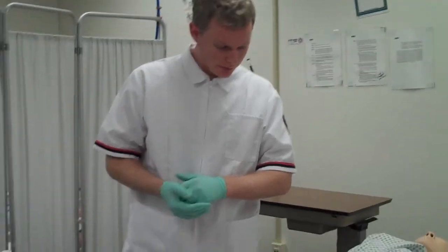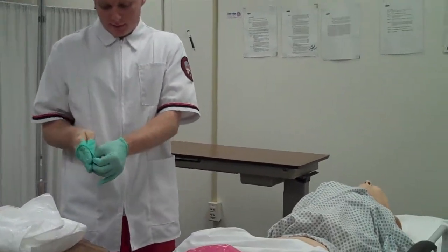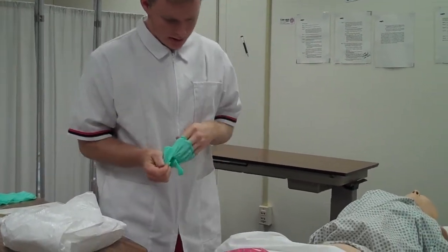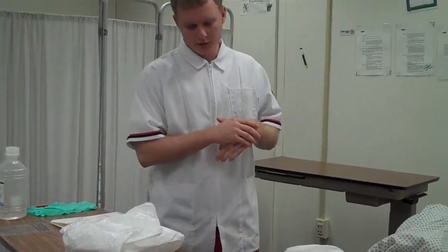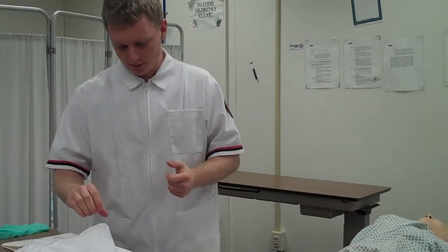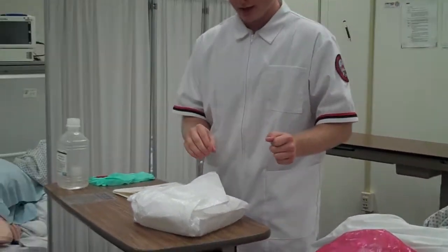Now what I'm going to do is take these gloves off and dispose of them in the trash. And then what I'm going to do next is prepare my sterile field, have my solution, tape, everything ready.